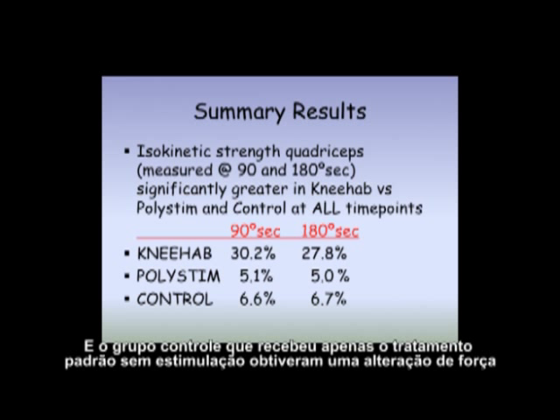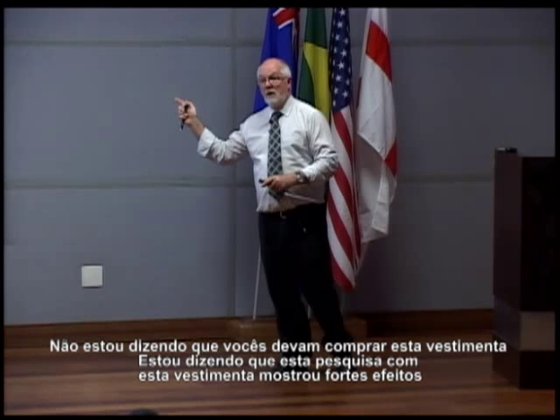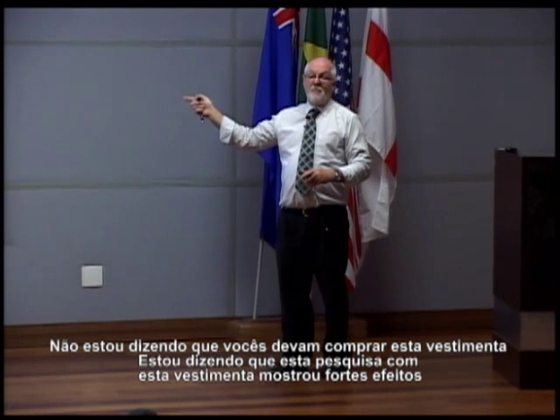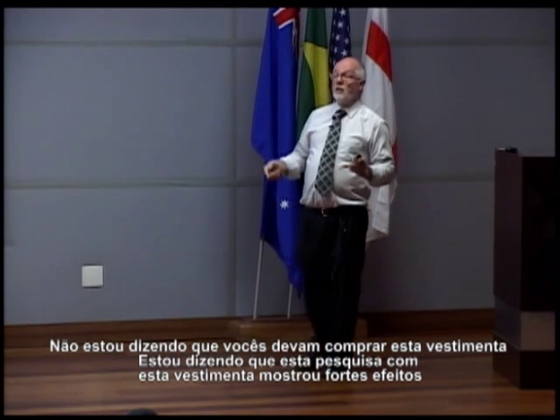And the control group, who have just standard treatment, no stimulation, they get a change in strength. But the ordinary stimulation and the control group, there's not a lot of difference. The advantage appears to be, for this trial, that the garment stimulation is good in this research. I'm not saying you should buy a garment, I'm saying the garment research here was having a stronger effect.